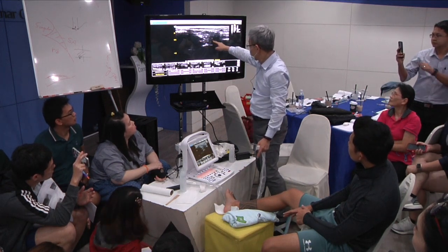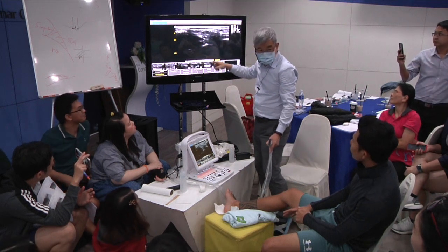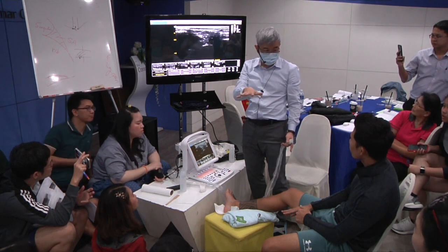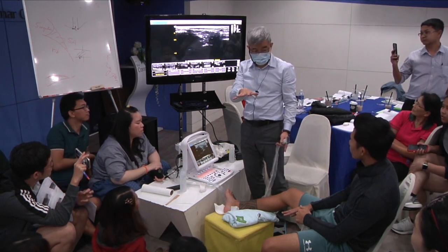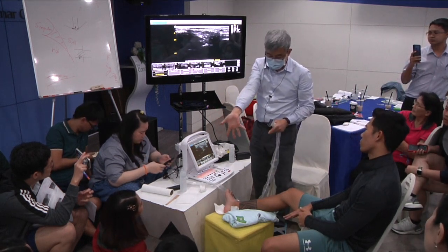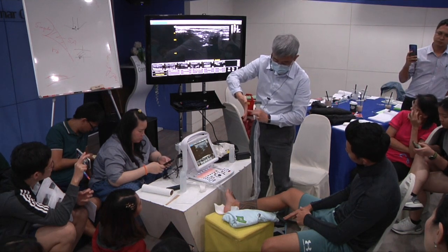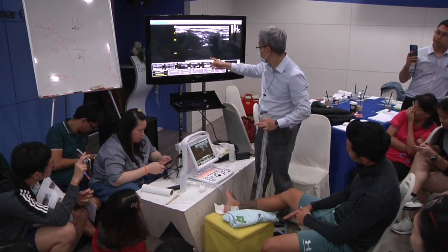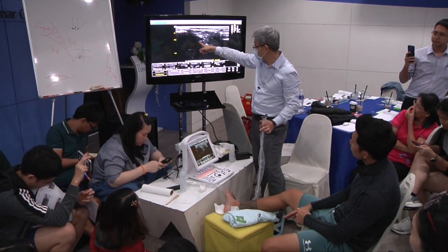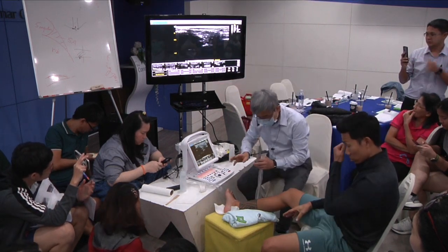This is the ligament. Because the deltoid ligament is diverse, only a few bundles can be seen by ultrasound. If I'm looking for the middle bundle, there are some bundles beside the middle bundle that can create shadow. But we can see one bundle very clearly. That's the middle bundle.